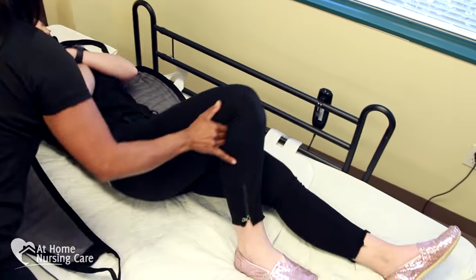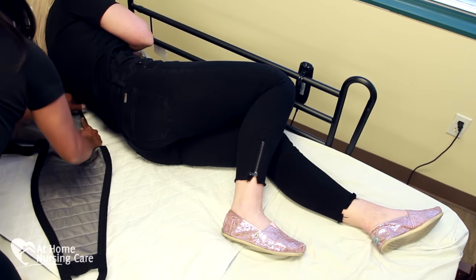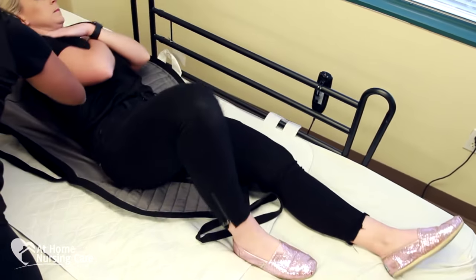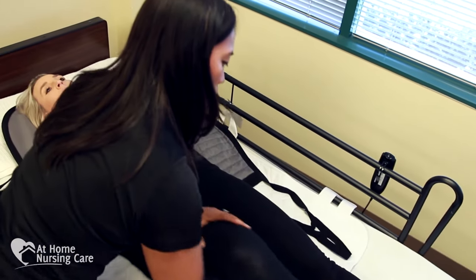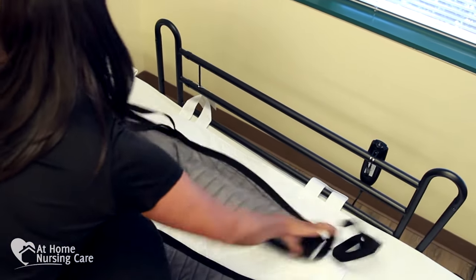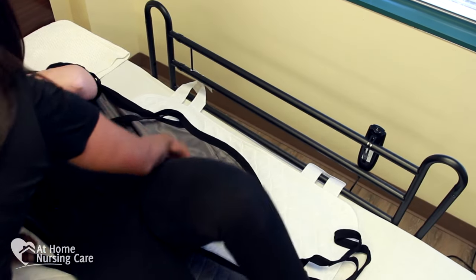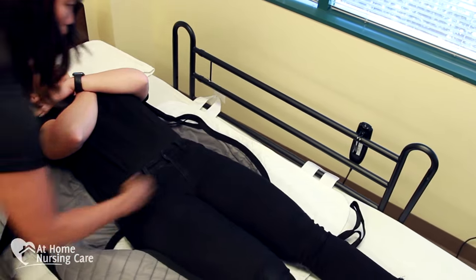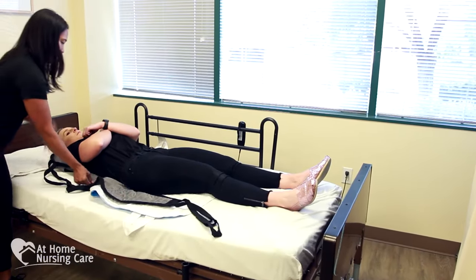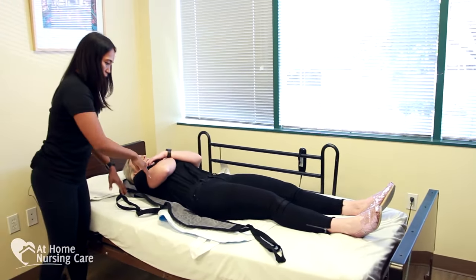I'm going to have her bend her knee and turn onto her side, and I'll pull the sling as low as I can — she's assisting me. Then she lies back down, and I pull it down as far as possible, then turns the other way, bending the knee and coming over. Looking for the base of her spine, pulling the sling down, then coming back down. The landmark you're looking at is the very base of the sling to the base of her spine. I'm also checking for evenness on both sides of the sling — I don't want her off-kiltered.